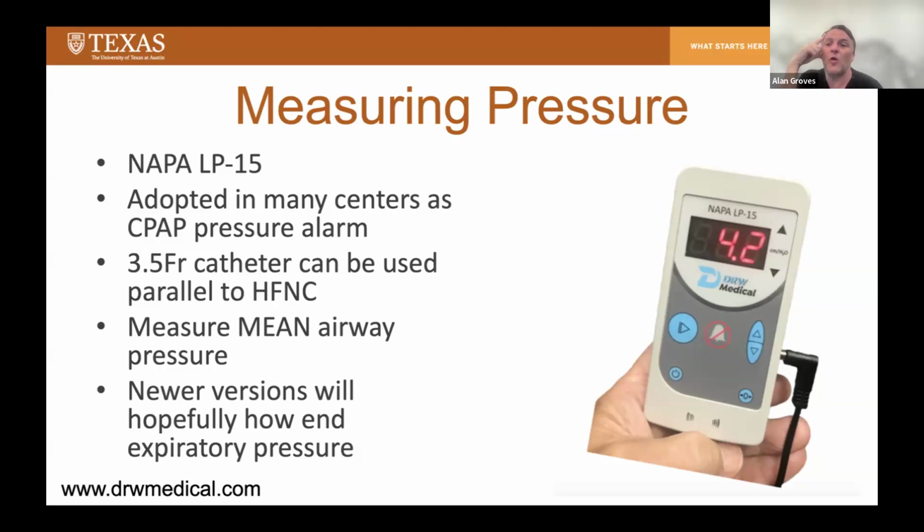But one of the things I'm hoping to be able to prove to my team is that we should include this in our standard clinical protocol, that anytime we put a baby on high flow, we should measure the pressure that we're generating rather than having to guesstimate how much we're giving.